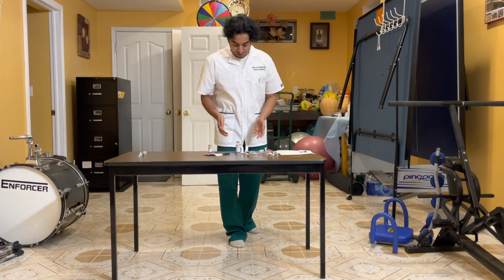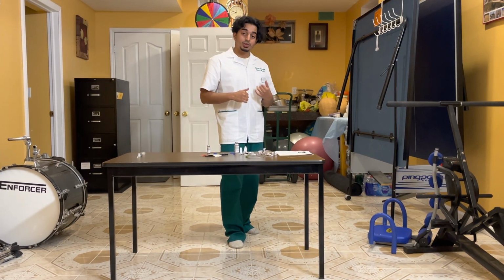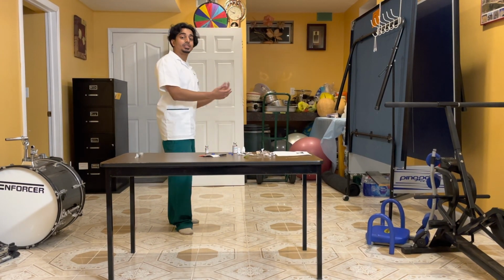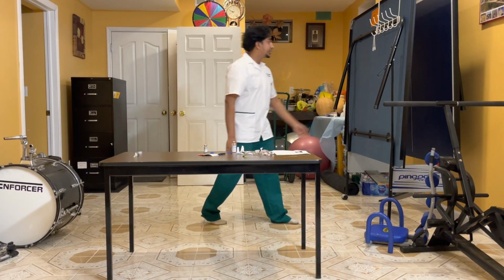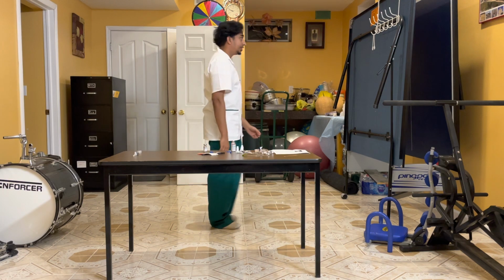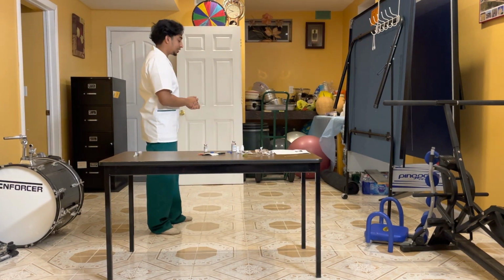Now that we have the medication all ready to go, I'm going to be going to the patient's room. Now I have entered the patient's room, this is the patient right here. This is the normal IV bag right here. Okay, I walk into the patient's room.